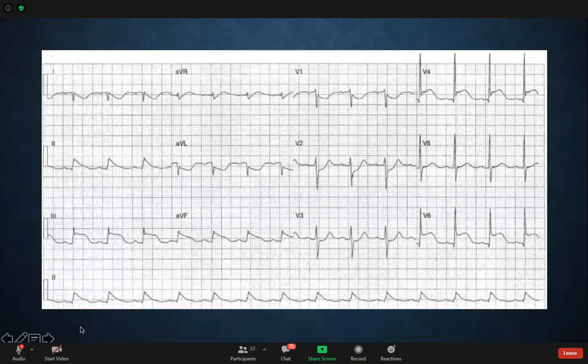Who wants to try to take the ECG? Doctor, I'll take it. Yalla, go for it. Let's see. Ahmed, yalla.